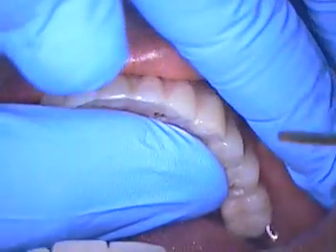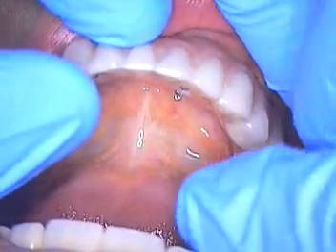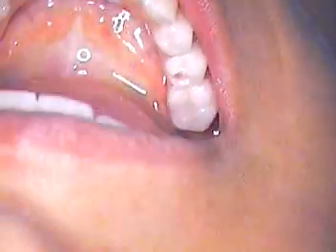We're going to go ahead now. You okay? Everything fine? Okay. She's not pinched anywhere, so let's go. We'll put the first one in. That one's in. And just hand tightening gently. You okay? I'm just keeping your cheek out of the way. Okay. And here. Sneak that in. It's got a slight angle to it. Let's see. Okay, that one's down. You okay with that? Yeah, we're good.